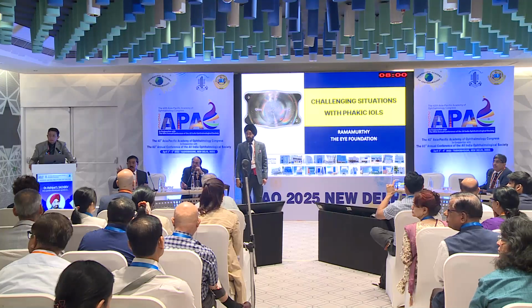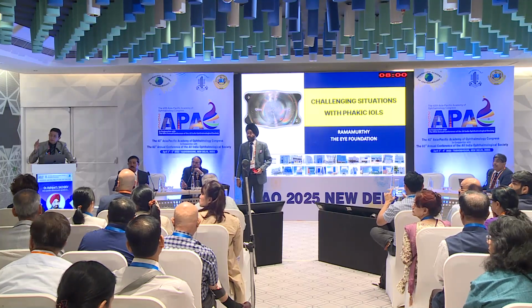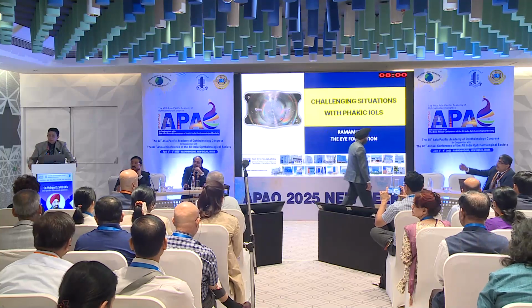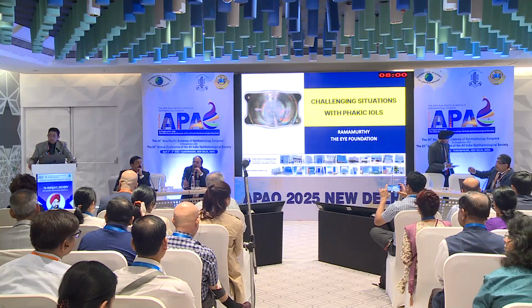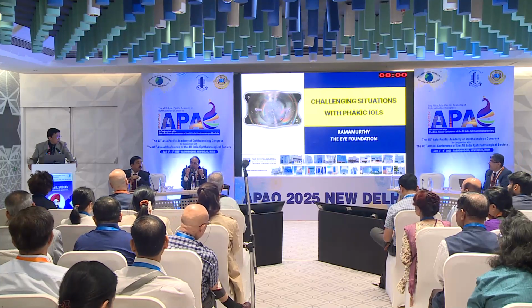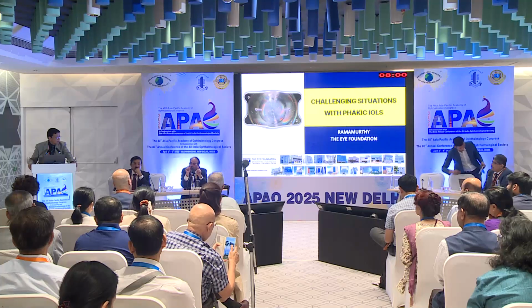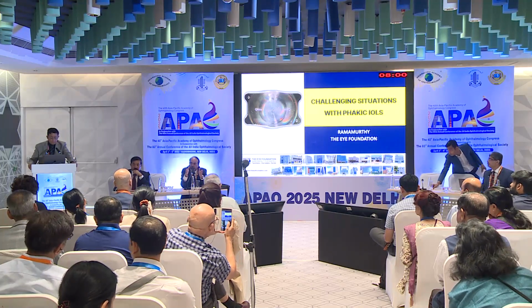Yes. But I have a little trouble with limbus anatomy. Sometimes, because of the arcus or something, you get it wrong when you see it under the microscope. I think we should proceed with the talk, we can discuss it. Though the most important fact is that you are measuring white to white and not black to black. So you go just beyond black to black, which is white to white. That is the ideal.